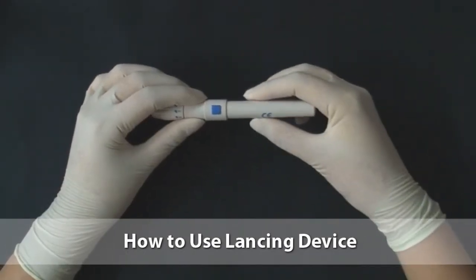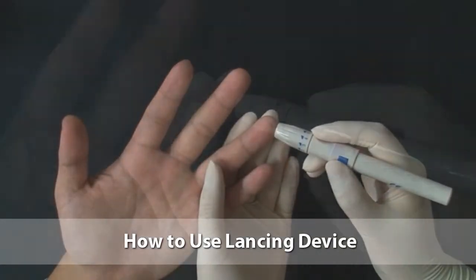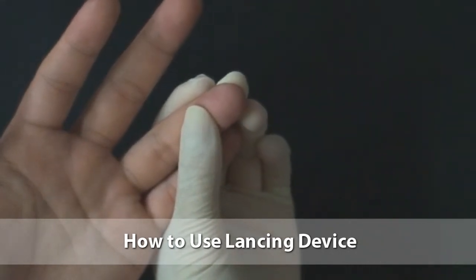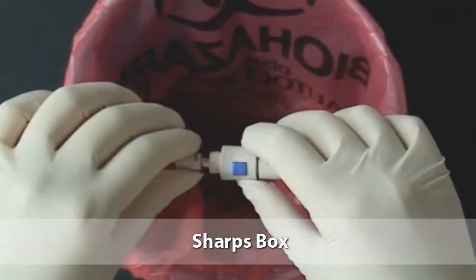Pull out the lancing device body as far as it will go and then release it. It makes the lancet ready to prick. Push the blue button on the lancing device. Inside, the lancet will prick the patient's finger. Discard the lancet immediately after pricking the finger.